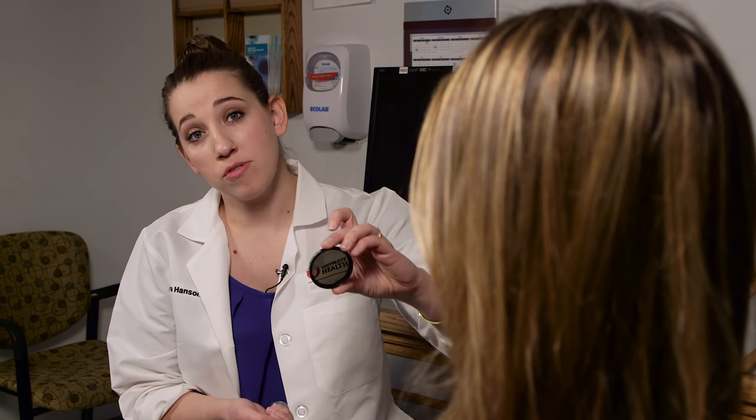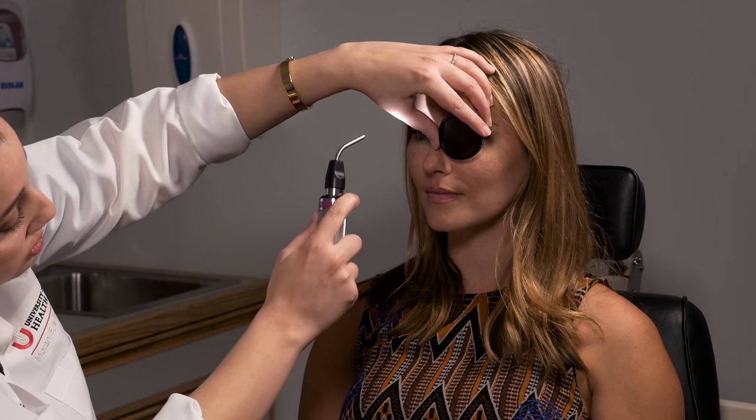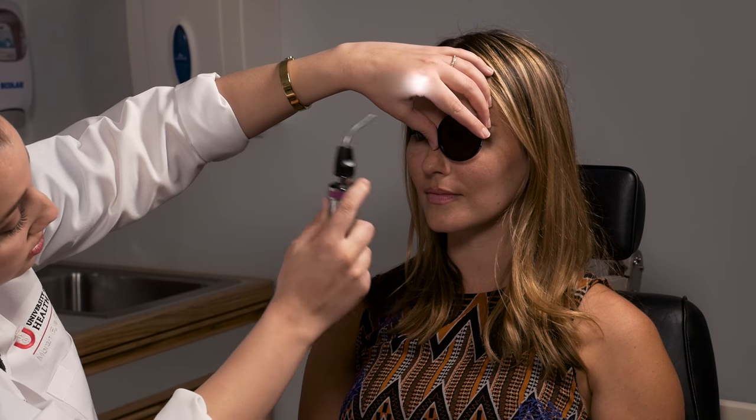For demonstration purposes, I'm going to try to induce an afferent pupillary defect on the left side. I'm going to hold the neutral density filter over the left eye. The left eye will perceive less light and the pupil should dilate on the swinging light test. This is the swinging light test — instead of constricting on the left side, the pupil dilates slightly.